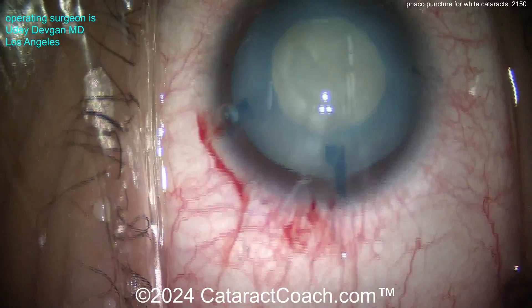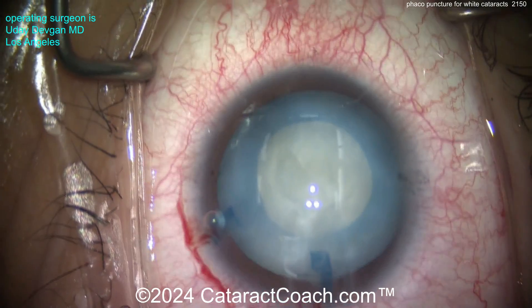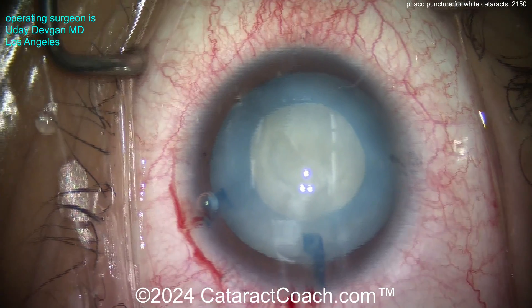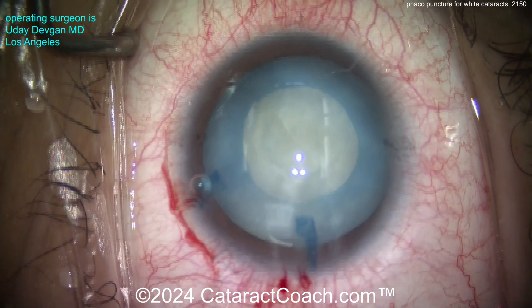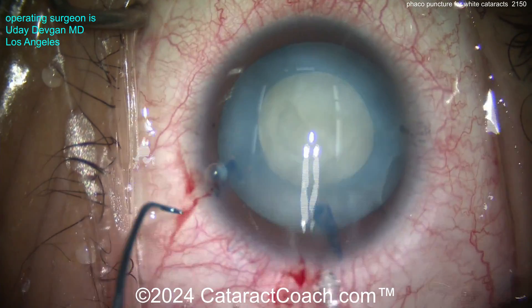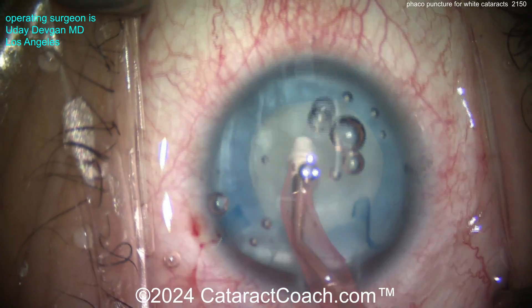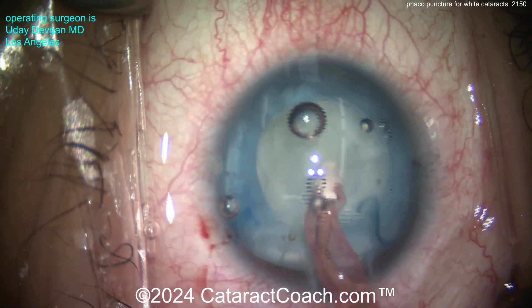Look at that. Now look at the eyelashes — young patient. What do you think the lens density is here? How much density is in that nucleus? Very, very little. In fact, you probably don't even need the phaco probe. Let's go in with the IA probe — coaxial IA — and just aspirate all the lens material out.